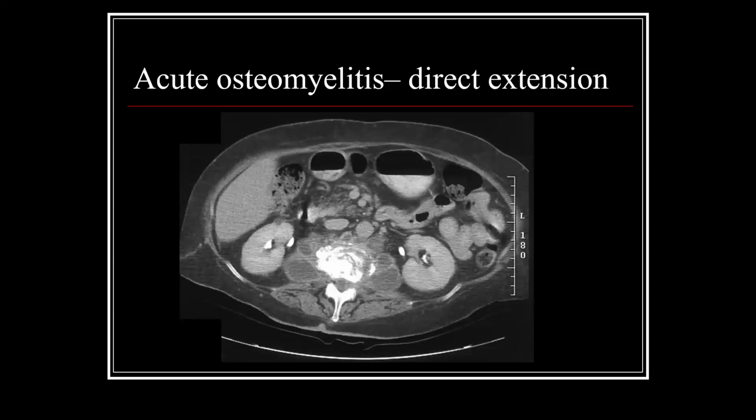So some of the times you may have acute osteomyelitis secondary to direct extension. So here you see the spinal process here.